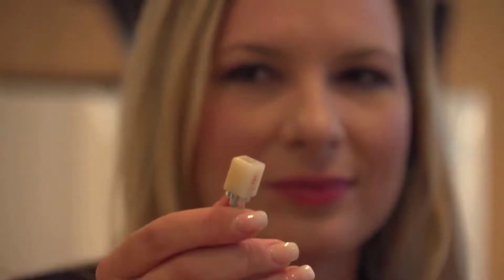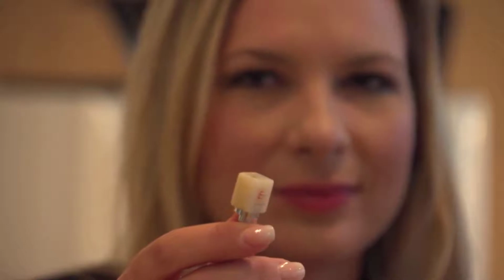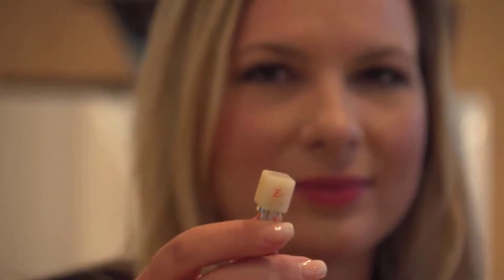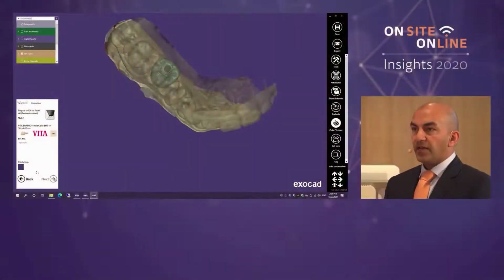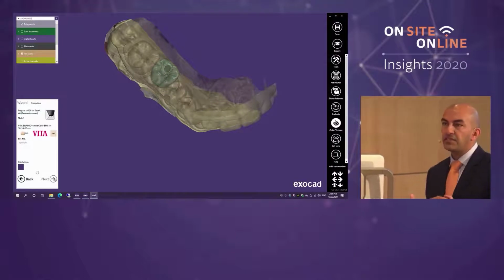I got first questions from the internet audience. Fire away, Michael. What do you have? So what kind of indications do you do chairside? I am quite happy to do single posteriors, quadrant posteriors, anteriors. Me, generally, I'll do single anteriors without a problem.